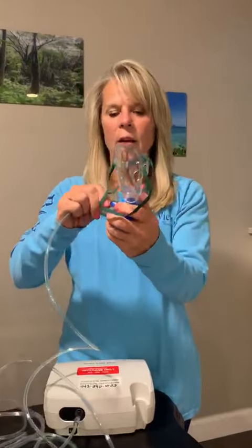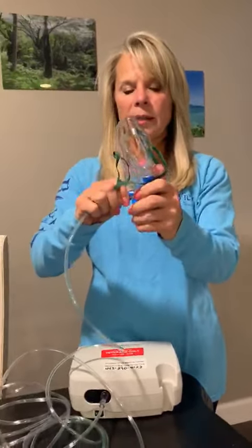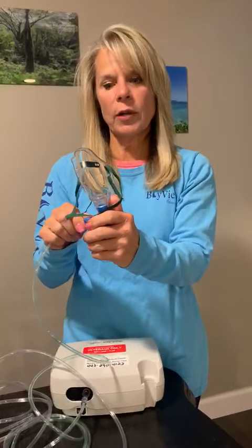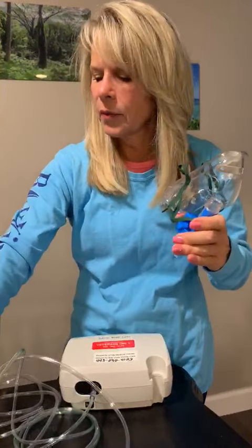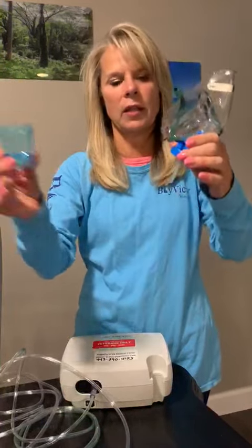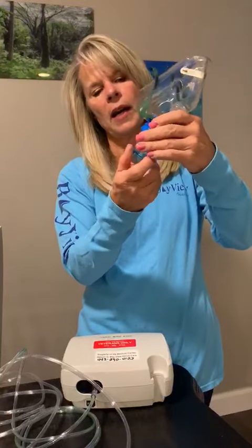This is part four, and this is about cleaning your supplies. After you've taken your treatment, you're going to remove the tubing, unscrew the bottom, dump whatever medication is left in there, and then put it back together.